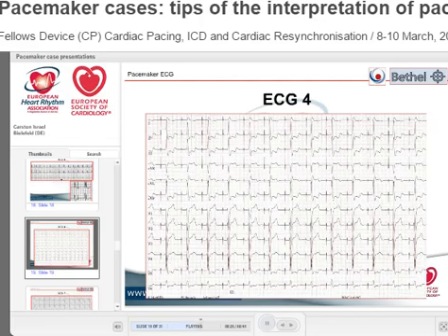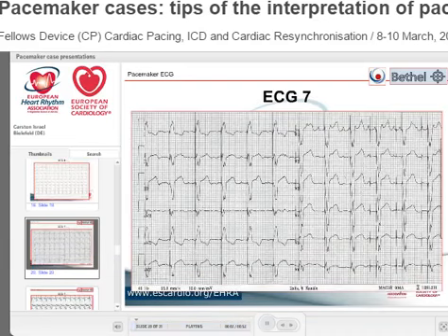This is too difficult. I'll skip it. It's big fun for me, but maybe not for you. This also. This is very funny. I'm not sure if anybody understands this. This is what happens sometimes in my patients.